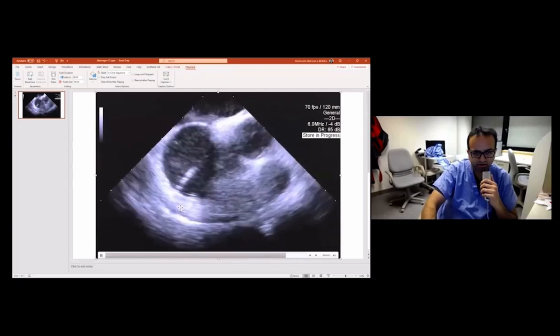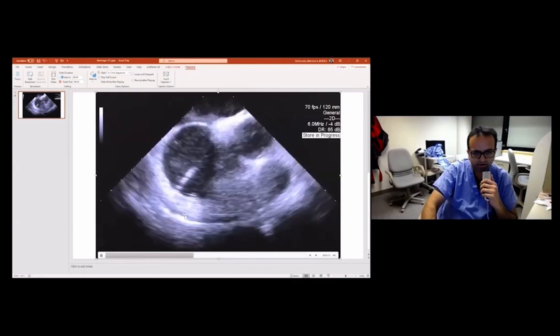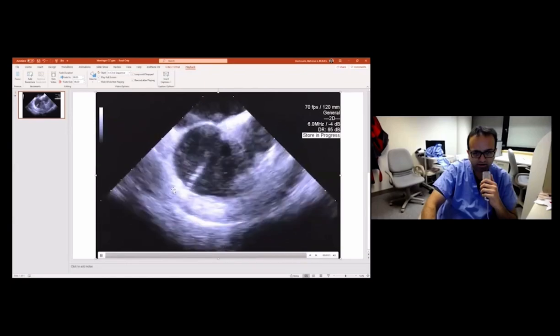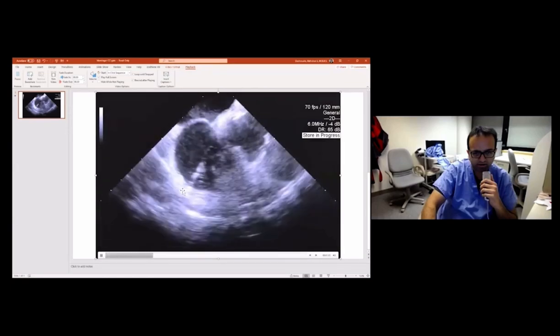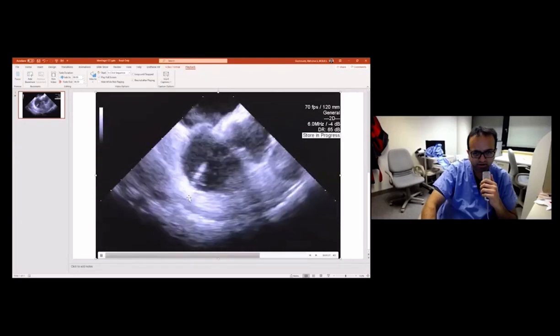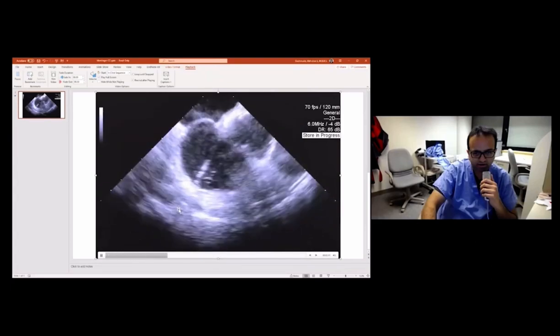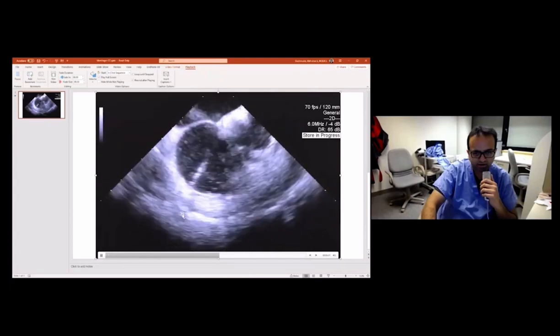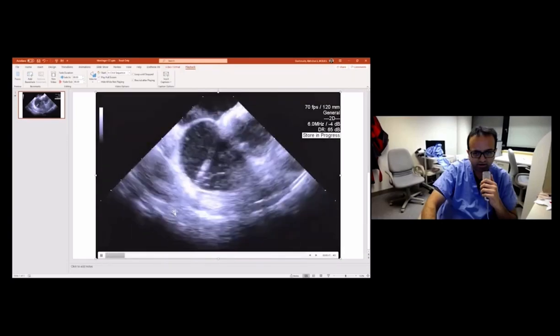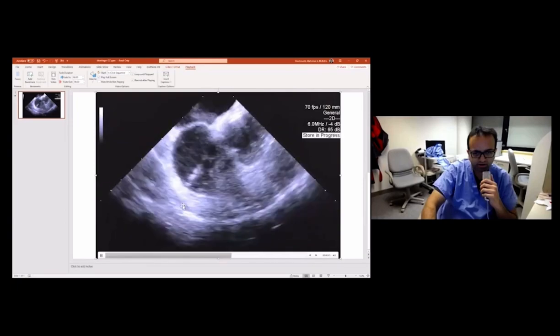As we are looking at it, behind this, you will see there is a vessel, which is the coronary sinus, and that sometimes acts as a heat sink area. Now, the unique thing about this case is whenever we are ablating here, one could see a far field atrial signal in addition to the near field left atrial signal. So that was our clue that while ablating, we were just not changing that far field signal. So at least in these cases, it's sometimes worthwhile going into the coronary sinus and ablating adjacent to this site from the CS.